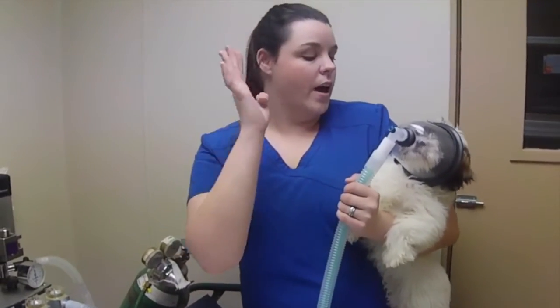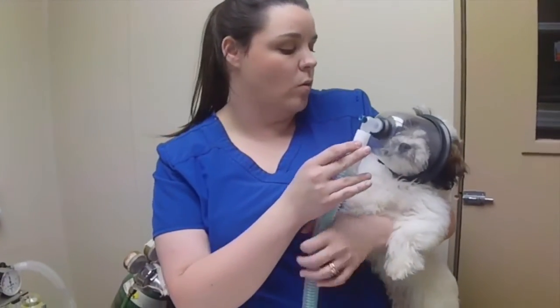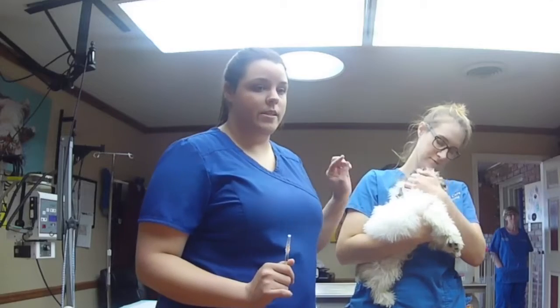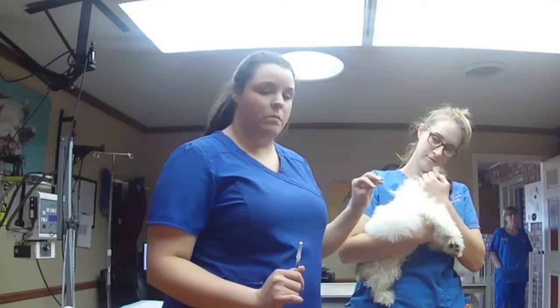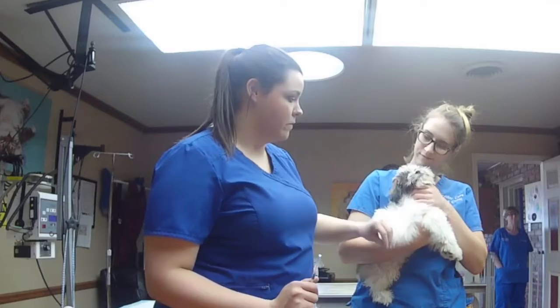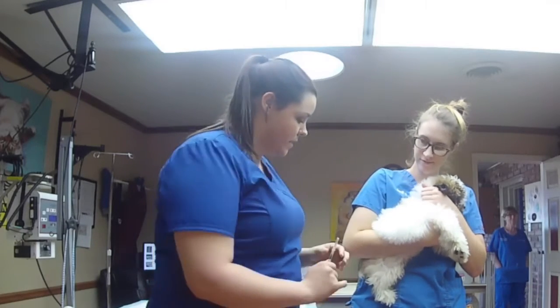We are pre-oxygenating our little neuter here. We are doing this for 10 minutes and then we will start his anesthesia process. Doing his anesthesia induction, we are going to give dexmedetomidine and butorphanol. Since he is little bitty, he's only 6 pounds, you're going to give it intramuscular into the meaty portion of his little thigh.